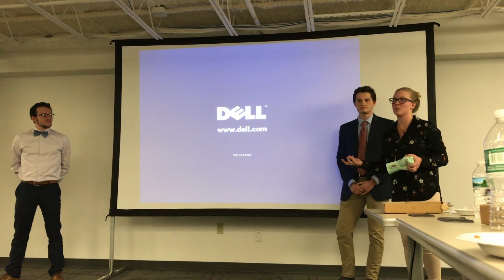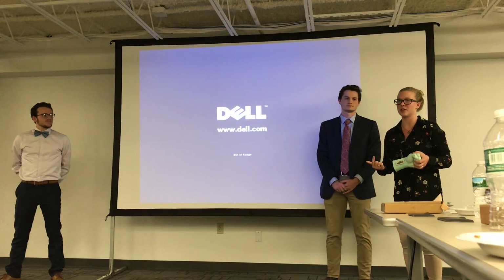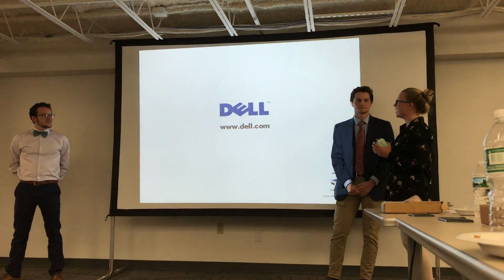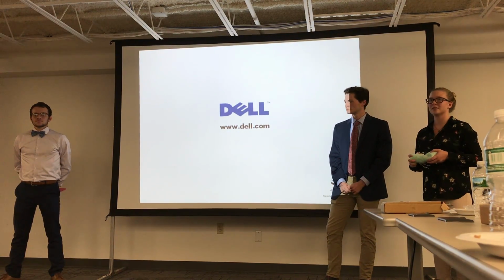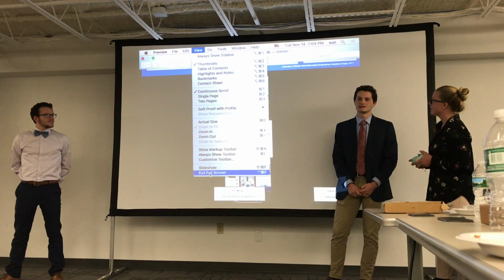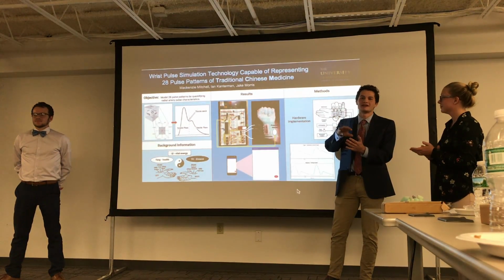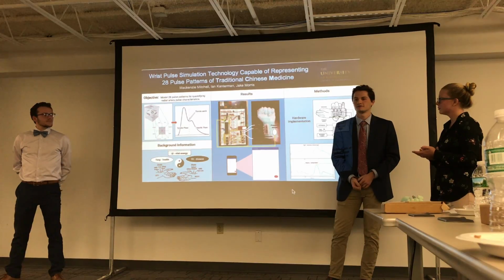But for other ones, they combine, like you can feel it at a certain pressure, and then the regularity is different than a regular pulse. I think the most difficult one has 5 different characteristics represented in it. Once we can, and actually we're well on our way of representing all 8 characteristics, we'll be able to do the 28 different pulses. For example, I think there's one pulse that is strictly characterized as the feeling of a guitar string, which is not something that you can easily picture or put into some kind of engineering model. It's strictly based on the feel beneath your fingers.